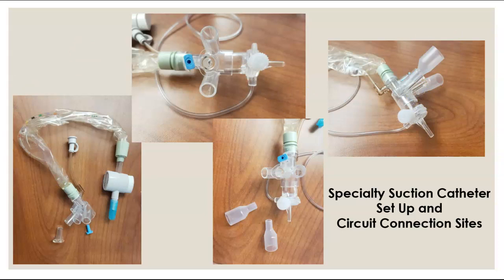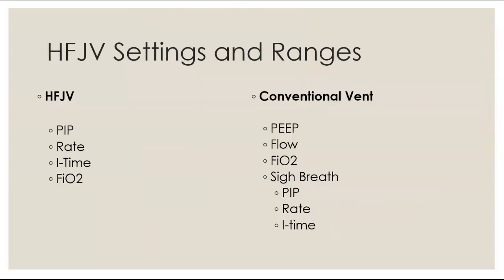For new RTs, this is probably the most intimidating part, setting up the jet. Managing it is helpful and appropriate, but you can work it through. Setting up the jet is a little intimidating, but just take it a step at a time. Set up one ventilator, then set up another, and then move from the ventilator out to the Y. That's just my trick when you're learning to set this up. My little tips and tricks.